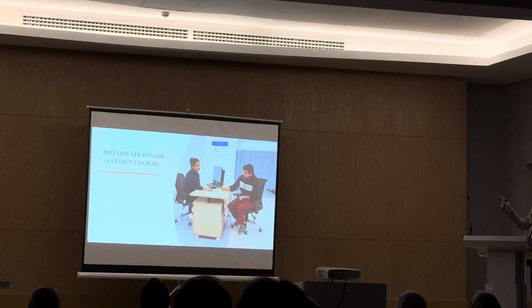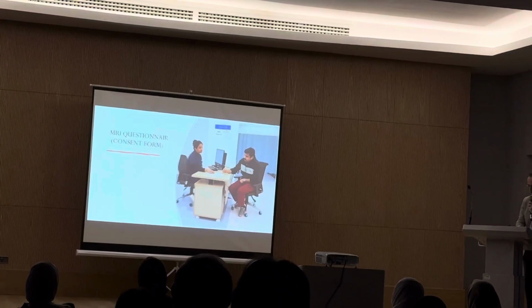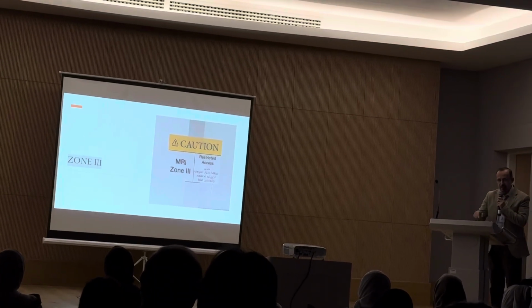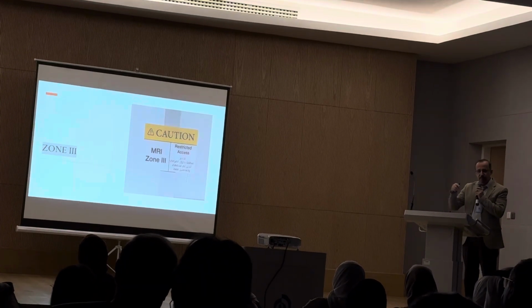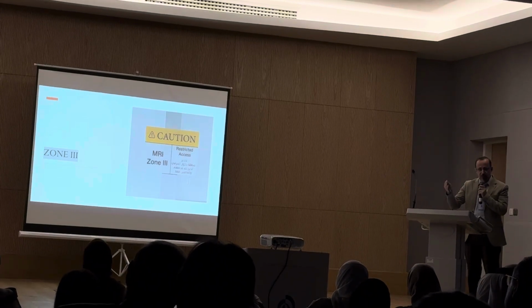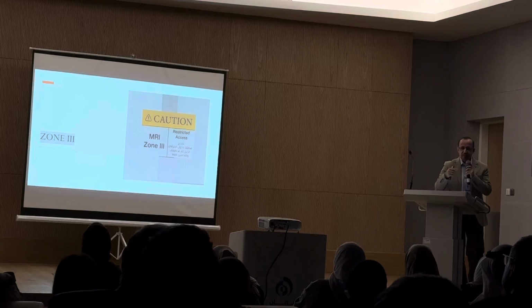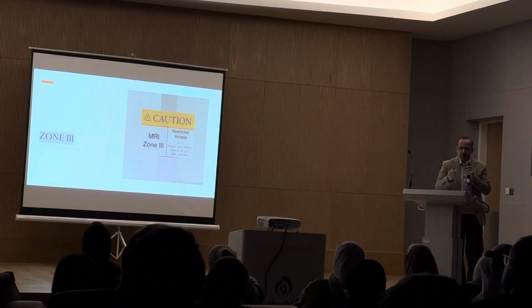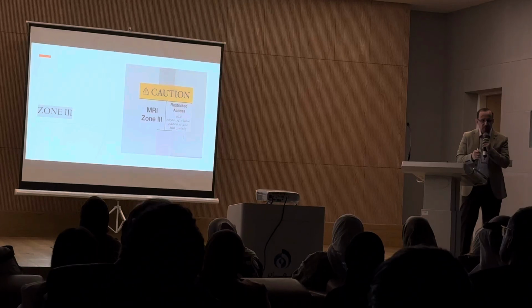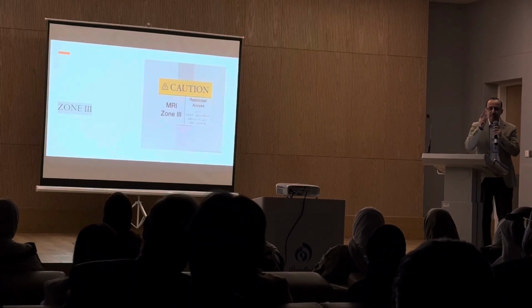And this is the stage of signing in front of the nurse. After clearance from this area, the patient is to be transferred to the third zone, which we call the zone after clearance. At this stage, a radiographer level 2 takes care of the patient, which is a radiographer with detailed knowledge about safety of MRI, operating the MRI machine, and knowing how to deal with emergencies.